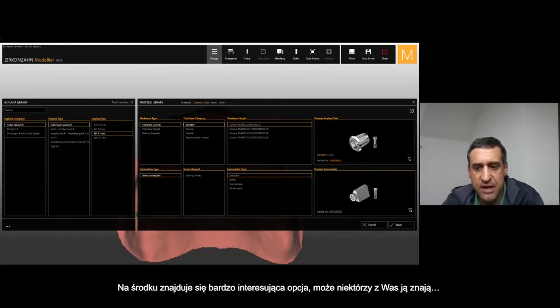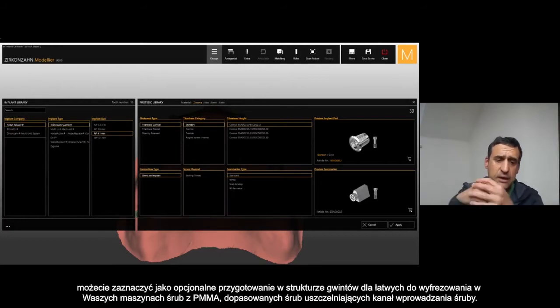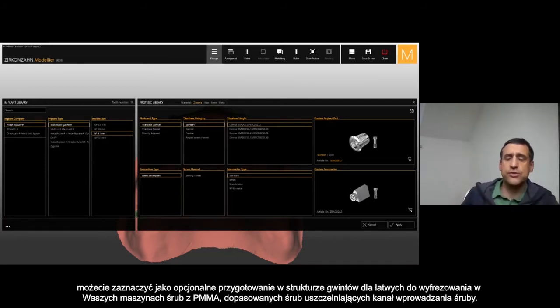Maybe not everybody knows that you have the option to select sealing thread. The sealing thread is when I select sealing thread, I get the option to have the sealing inside the framework. So I can screw inside the sealing — like a sealing thread inside plastic — that you can mill straight from the milling machine, and you can cover really accurately the channel screw.